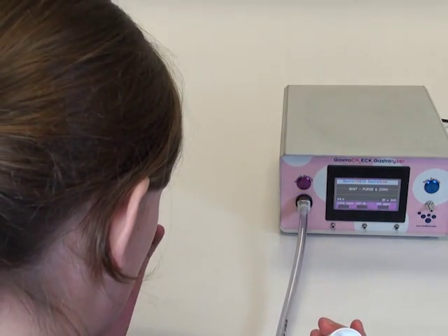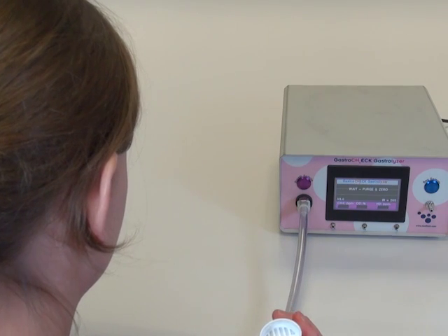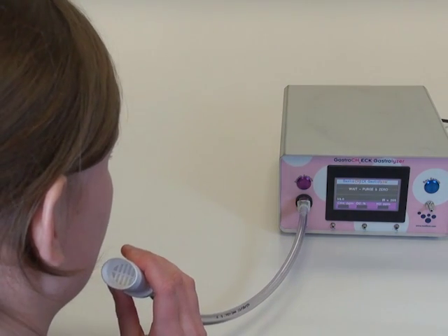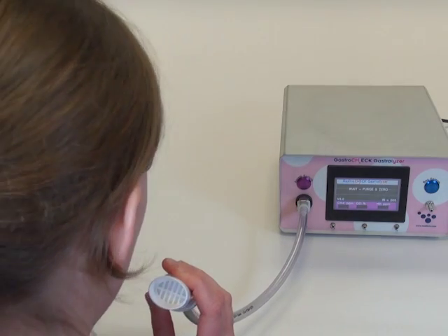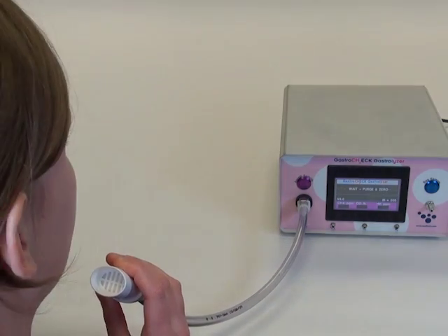The monitor will begin to zero, which will take approximately 60 seconds. You can take this opportunity to explain to the patient to exhale for as long as comfortably possible at a steady flow rate, emptying their lungs to ensure the end tidal breath is measured.